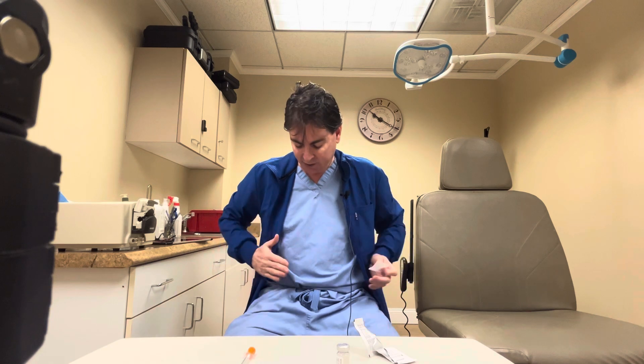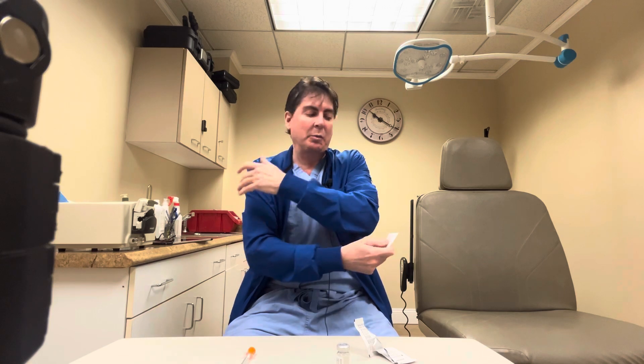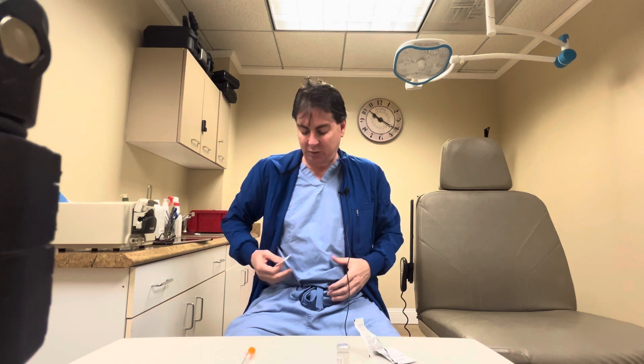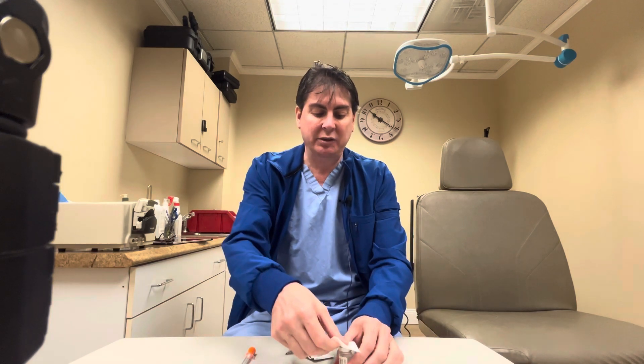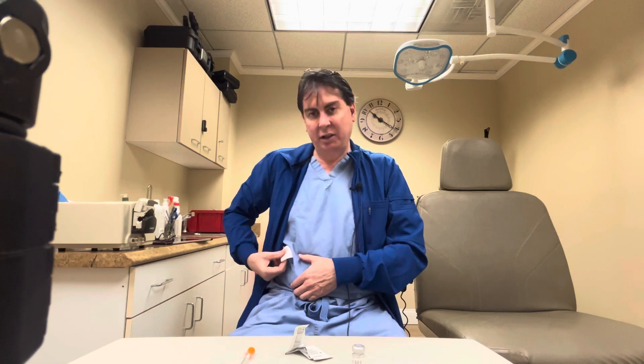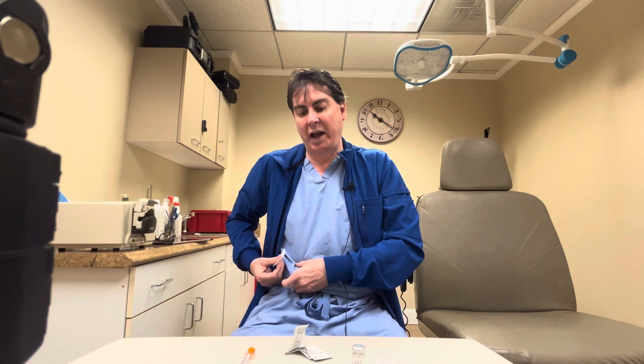You can inject in your inner thighs right or left side, your abdomen right or left side, or the posterior arm which is more difficult to do by yourself. When doing the abdomen or inner thigh, we suggest you do the right side one week and alternate to the left side the other week. You want to inject into fatty tissue, wherever there's the most fat.